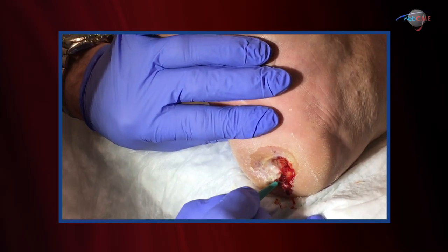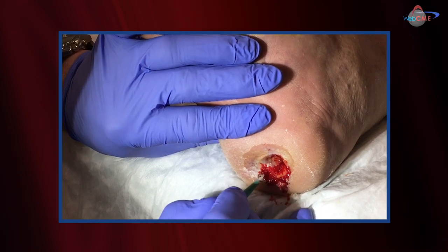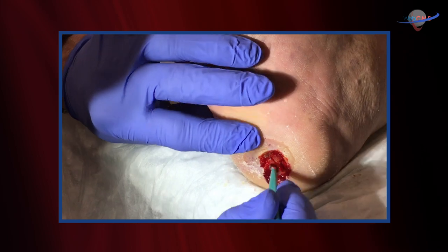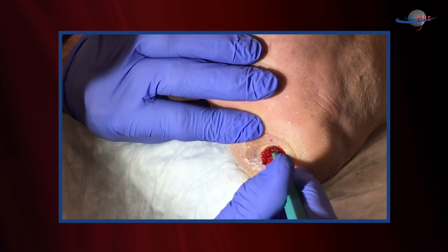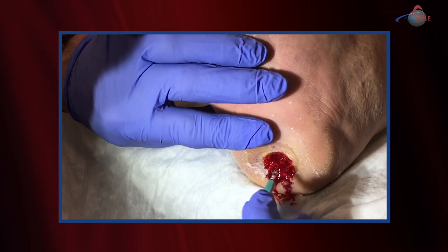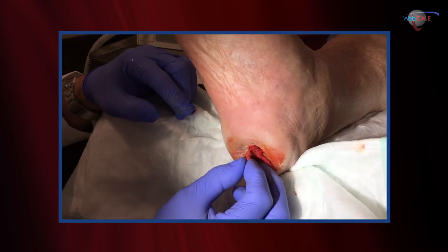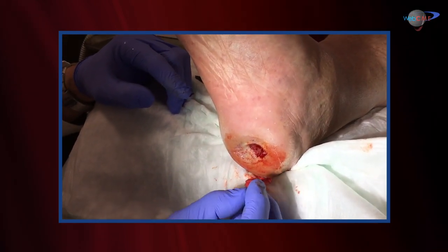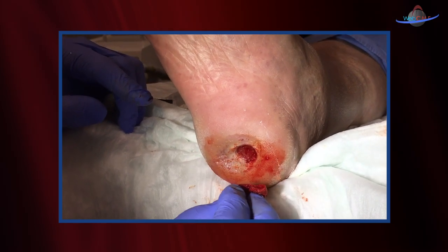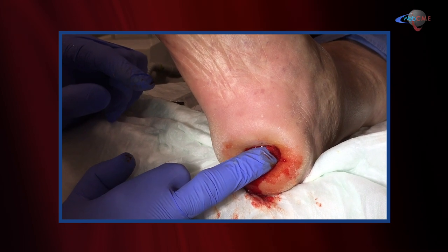You can see the tissue bleeds fairly readily — that's a good thing. Again, we're taking out all the margins, saucerizing the wound base. We'll come back and get that fibrinous layer. Healthy, bleeding wound base — we've debrided fairly nicely. Typically these ulcers will stop with a little bit of pressure hemostasis.